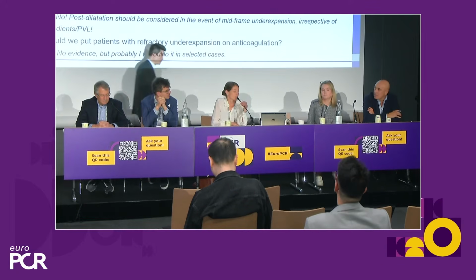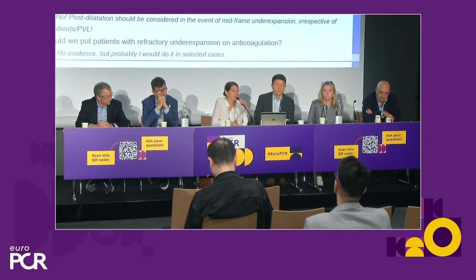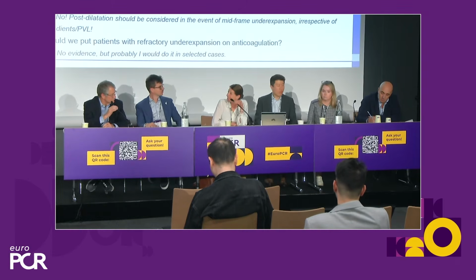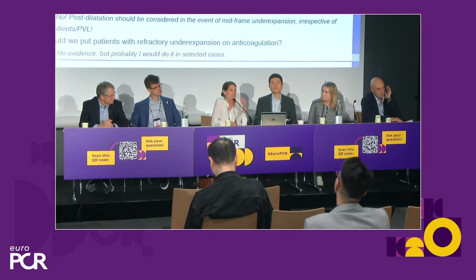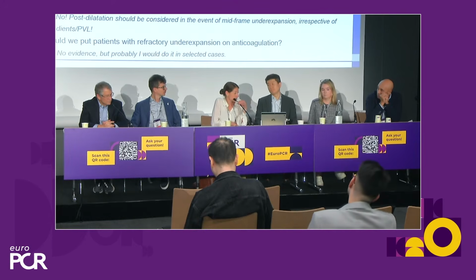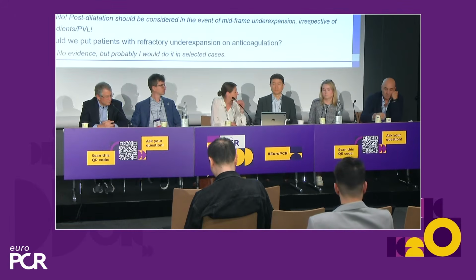Yeah, thank you so much for this very insightful presentations. Until we receive some questions from the audience, maybe I might ask Michael just one short question. What is your takeaway now if you're implanting an Accurate valve? Do you assess the hemodynamics, or do you assess first the underexpansion and then go immediately for post-dilatation before you even bother about other aspects why a post-dilatation might be recommended?